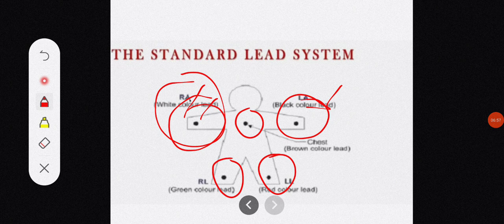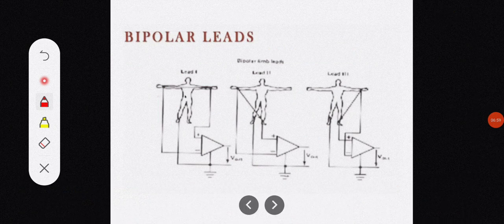With the introduction of the electronic amplifier, an additional connection to the body was needed as a ground reference. Although an electrode could have been positioned almost anywhere on the body for this purpose, it became convention to use the free right leg.